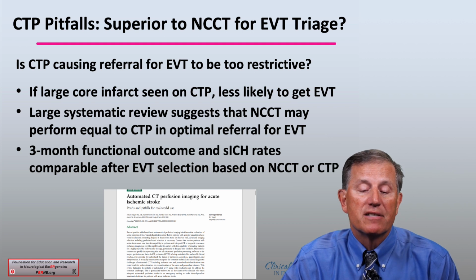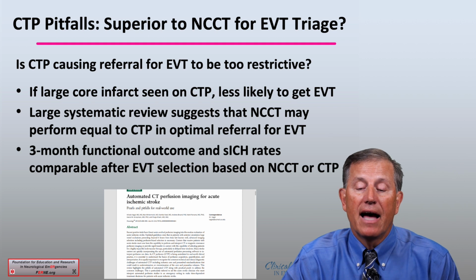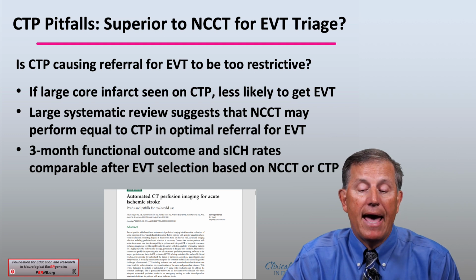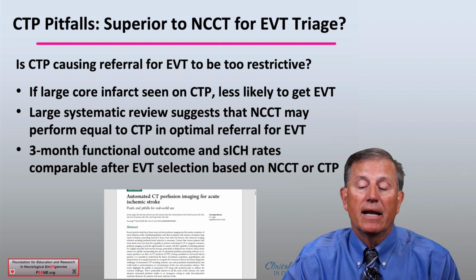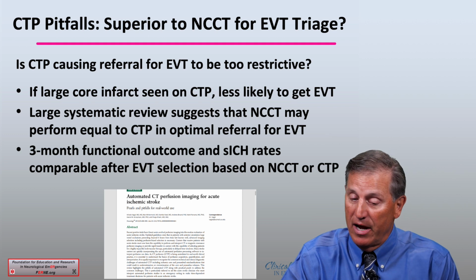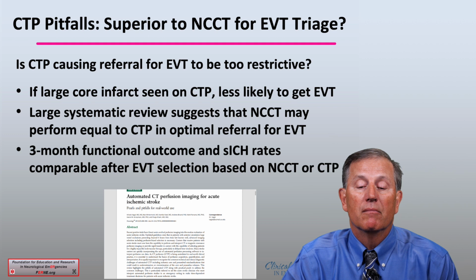A large systematic review listed here does suggest that a non-contrast CT may perform equally well to CT perfusion in the optimal referral for EV therapies. In fact, the 3-month functional outcomes and symptomatic intracerebral hemorrhage rates were comparable in patients who received EVT based on selection with simply a non-contrast CT or CT perfusion.